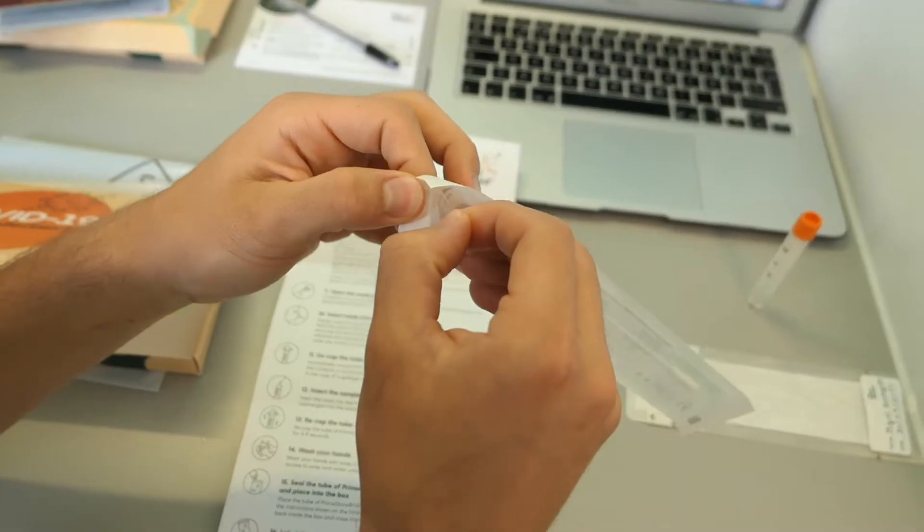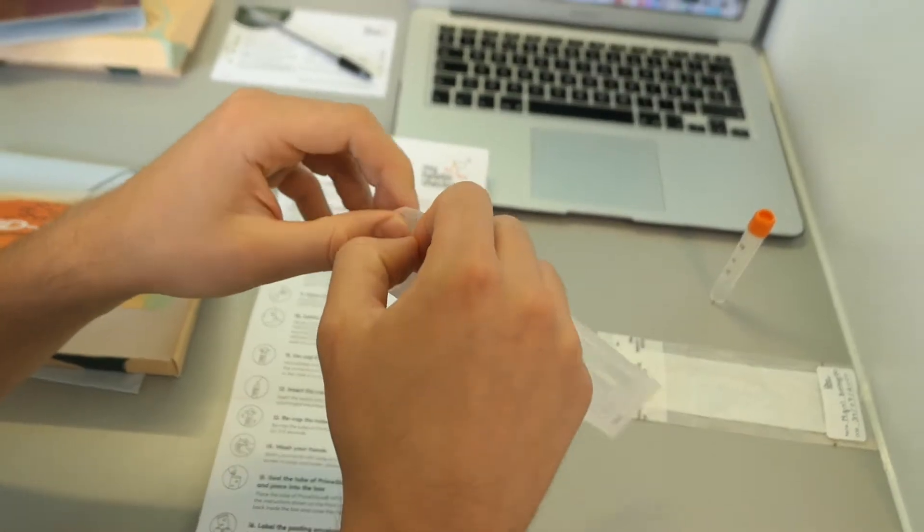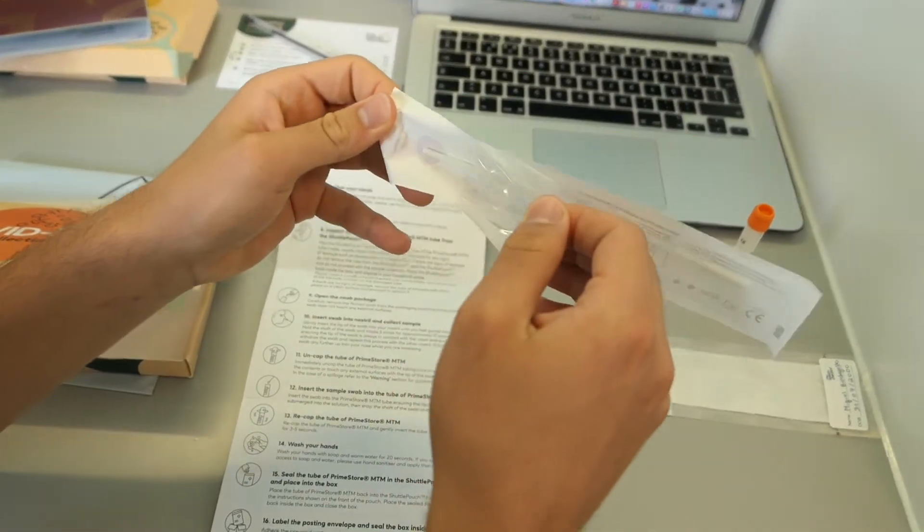When you're finally ready to collect your sample, make sure you first wash your hands with soap and warm water for 20 seconds. Also, check your nose and, if necessary, gently remove any visible mucus with a tissue. If there are no signs of leakage, remove the tube of Primestore MTM and place it on a clean surface.